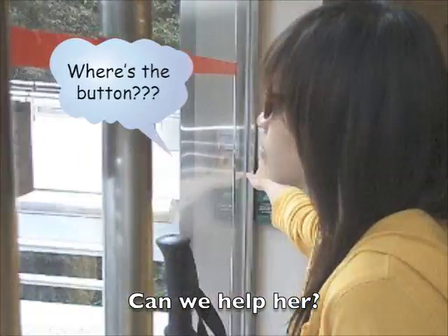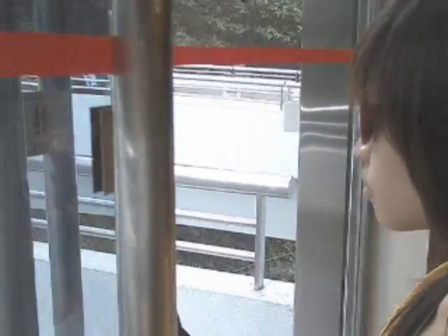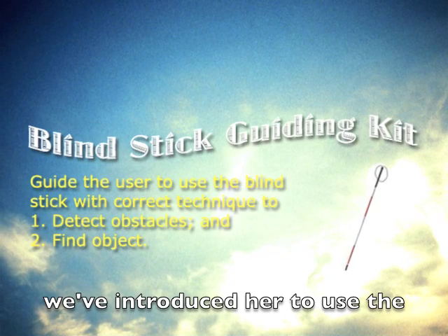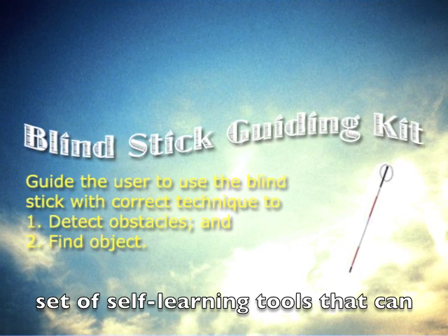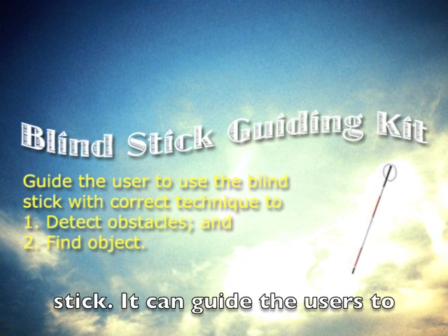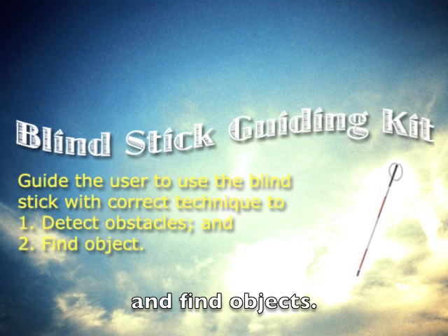Can we help her? In order to solve her problem, we've introduced her to the Blind Stick Guiding Kit, which is a set of self-learning tools that can be added to a traditional blind stick. It can guide users to use the blind stick with correct techniques to detect obstacles and find objects.